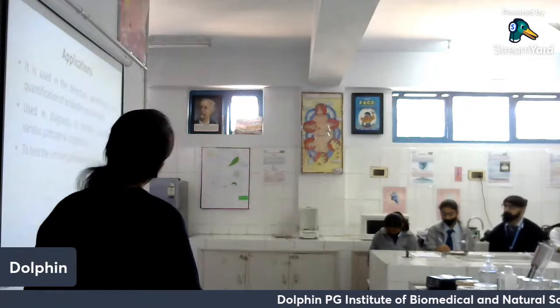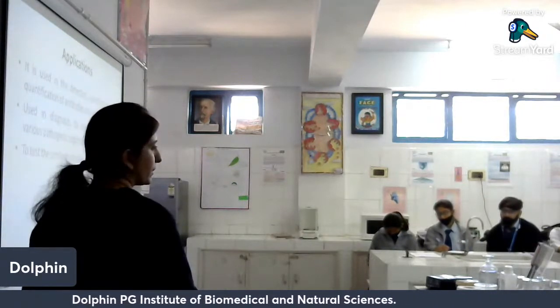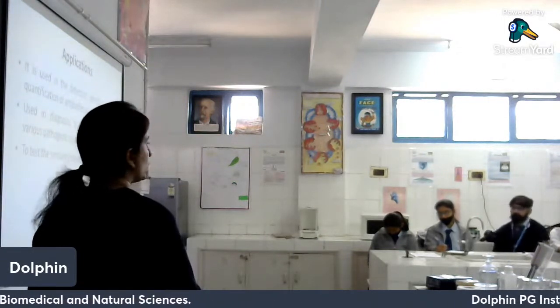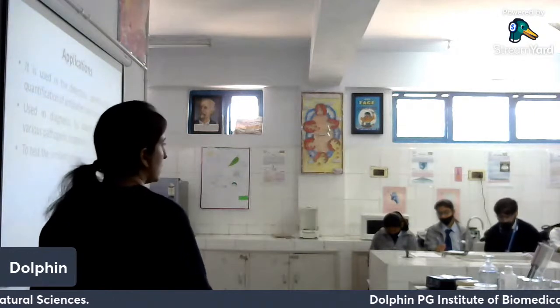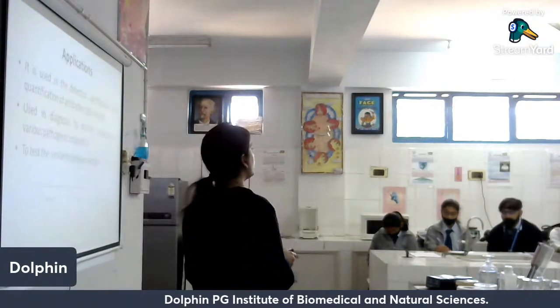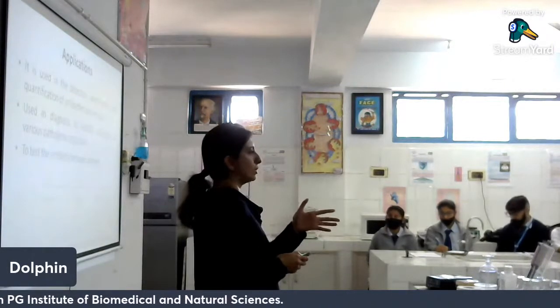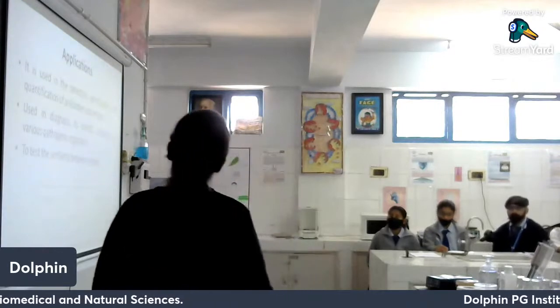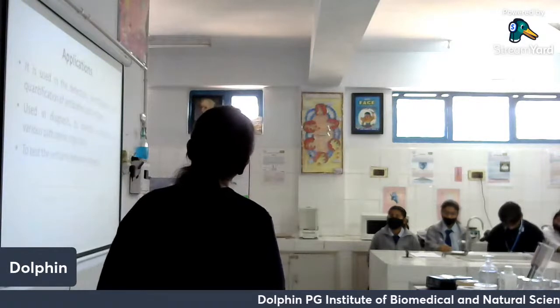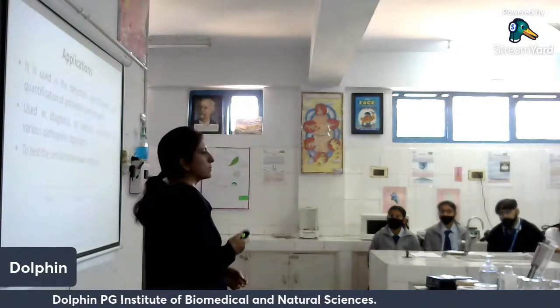And then we have these two antigens where the precipitin lines are crossing each other, suggesting that they have their own epitopes and these have their own epitopes. So there is no identity between these two antigens. To find out whether two antigens are identical, partially identical, or non-identical, this Ouchterlony double diffusion can be used. This technique is also used to test for the toxigenicity of some bacterial strains.